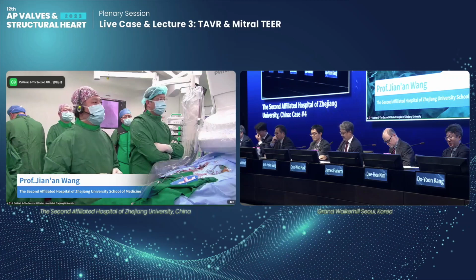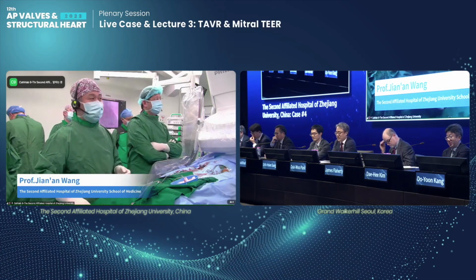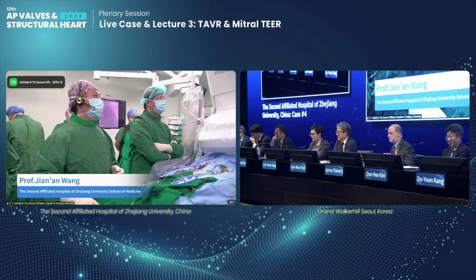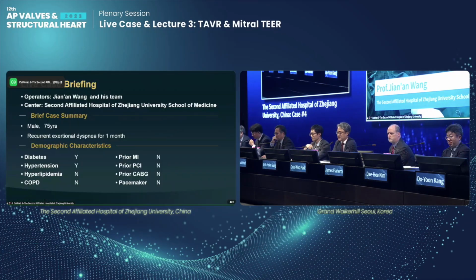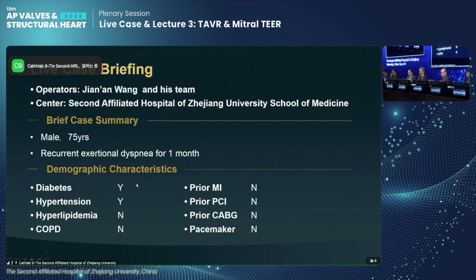Dear Professor Park, Professor Song, and the panelists, I'd like to introduce the case. The patient is a 75 years old gentleman, and the patient has had symptoms for over 1 month. He has a history of diabetes and hypertension.